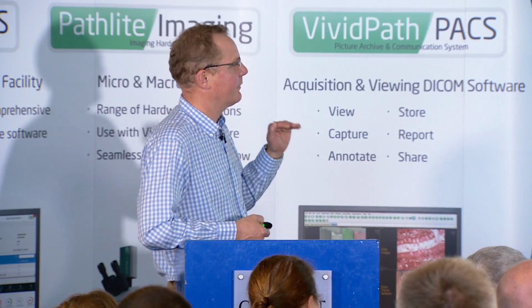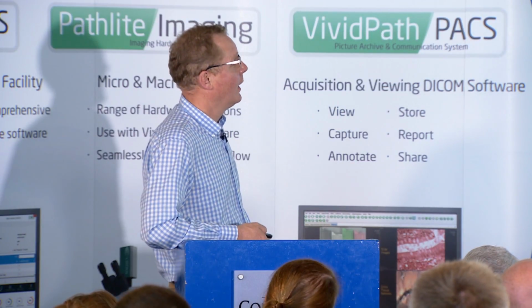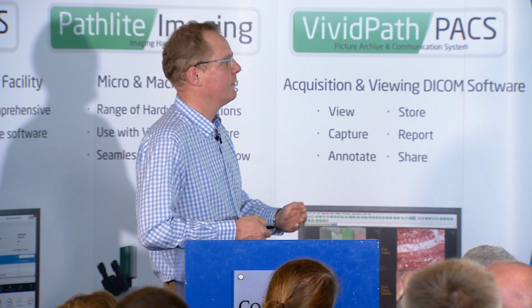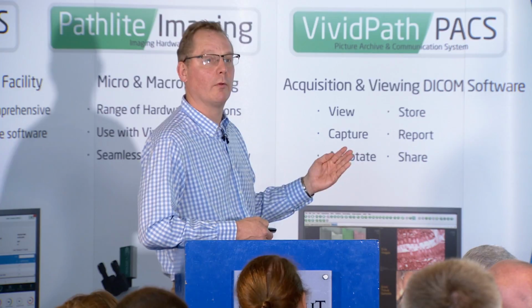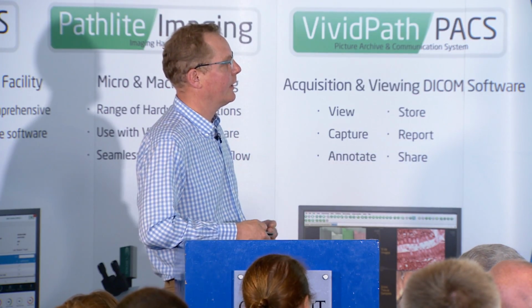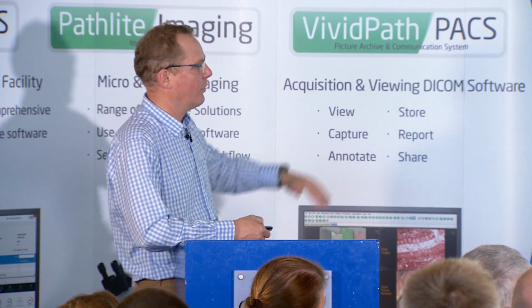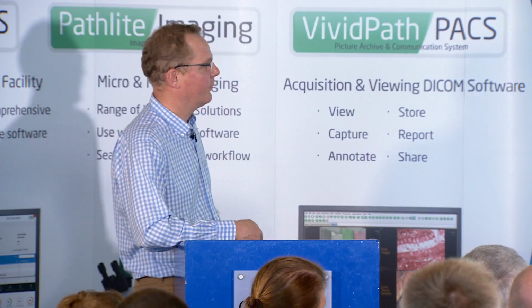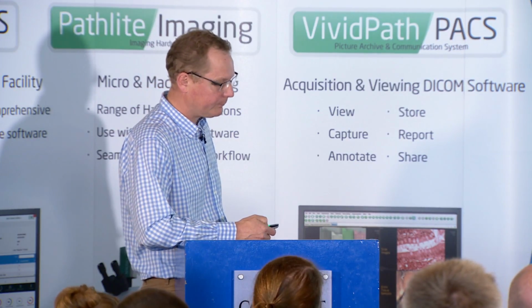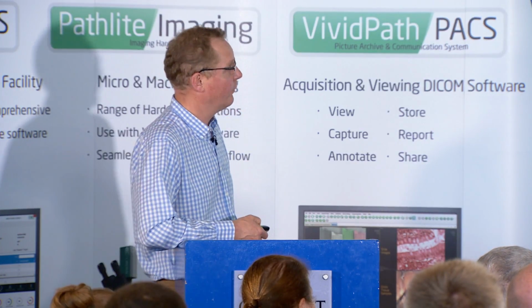The problem is if you're asking an algorithm to do anything on that, it can't do it, and it will fail the slide. And when we've run routine cases through our algorithms, this has been a recurring problem, that the quality of the scan is often not good enough to run the algorithm. So we need to improve that. And all of these scanners have this problem. They don't have good quality control over the focus plane in particular. So improving that is an important aspect for the future.